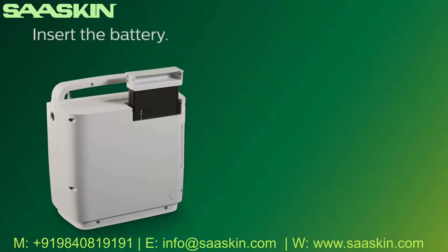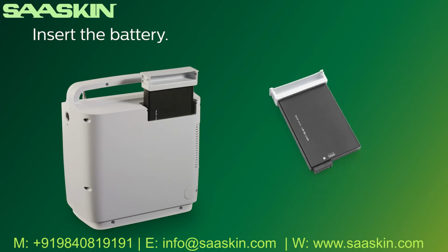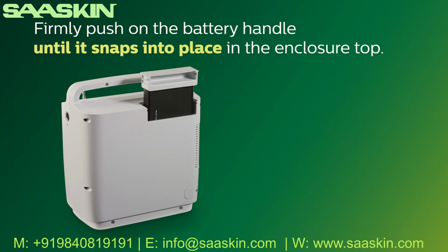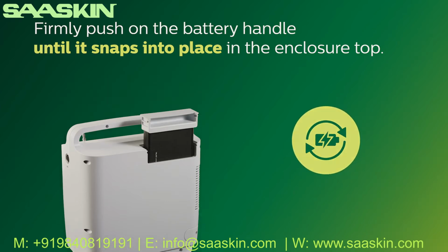First, let's insert the battery. To insert the battery, insert your fingers into the opening in the battery handle. Grip the handle between your fingers and thumb and insert the battery as shown. The battery compartment is shaped so that there is only one way the battery can be inserted. This will align the battery correctly. Firmly push the battery handle until it snaps into place in the enclosure top. The battery will begin charging whenever you connect the device to an AC outlet, even if you're using it.